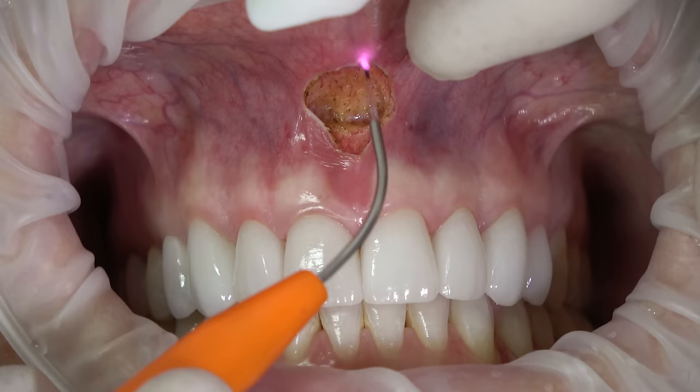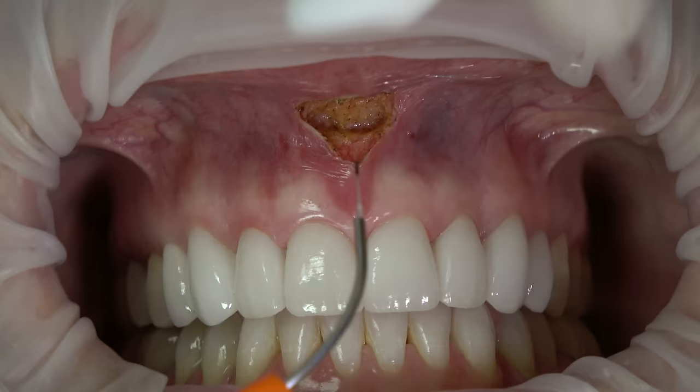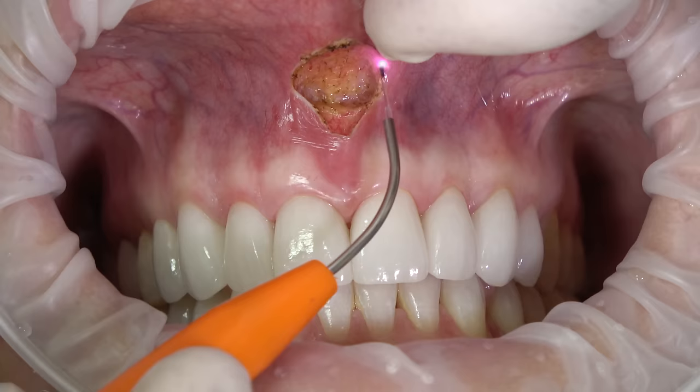We eliminated the fibrous attachment to the periosteum. Now we're going to clean this up, almost like festooning a denture — clean up the lateral borders and the bulky attachment. We've got a little bit of drag here, so I'm going to bump it up another 0.2 watts. I'm still only at 1.5 watts.